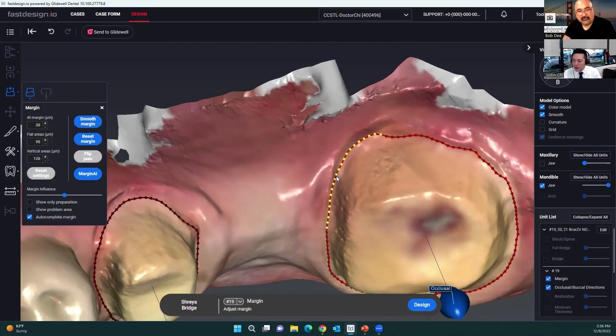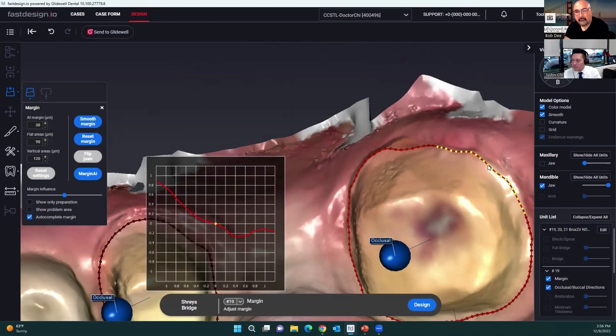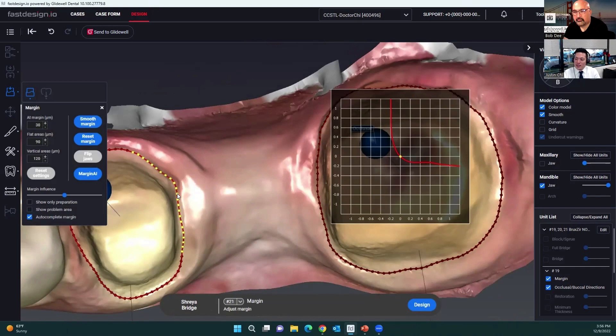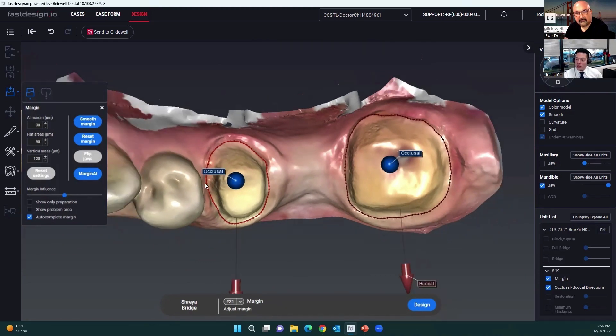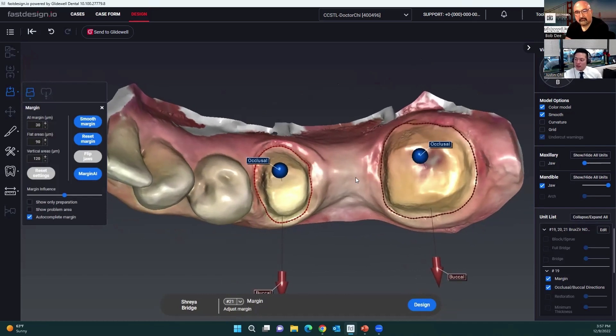Basically, because number 18 had moved forward, you call this 19, 20, 21 so the AI creates a premolar instead of a molar, because you don't have space for a molar. Exactly. There's nothing wrong with setting it up as 18, 19, 20 — the AI would create molar anatomy, it would just be really narrow dimensionally mesial-distal. Looking at that restorative space, premolar anatomy works out a little bit better.